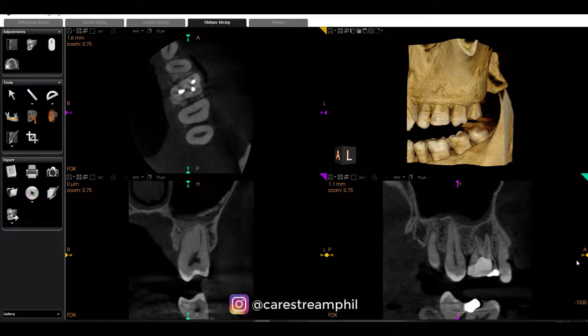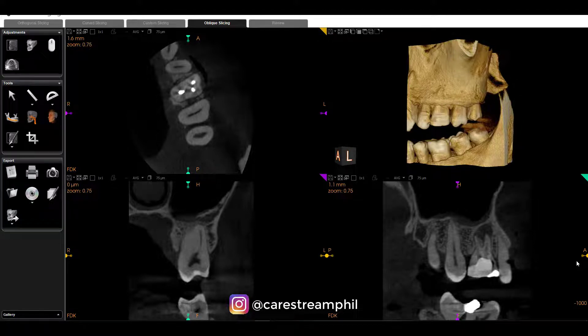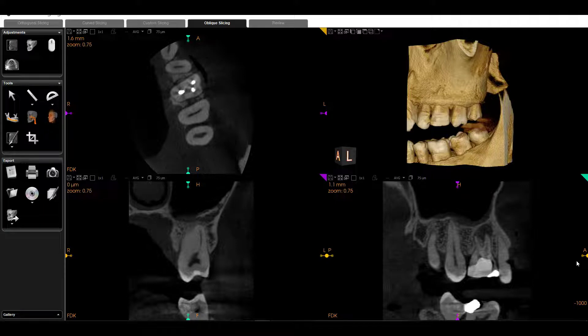This is Phil Leimberger with CareStream Dental, and I want to go through an endodontic case here. If you're an endodontist, this is probably a pretty run-of-the-mill case you'll see on a regular basis. If you're fairly new to CBCT, I wanted to make sure you can understand how to use the oblique slicing tab in the CS3D imaging software and how to manipulate the angles to visualize what you want.